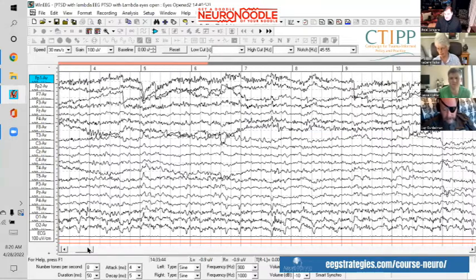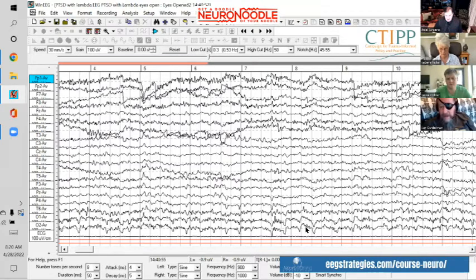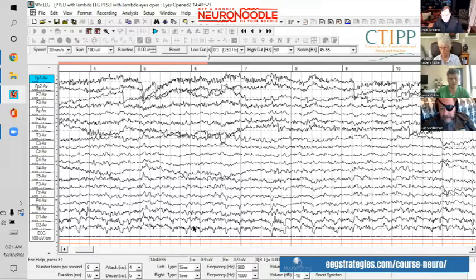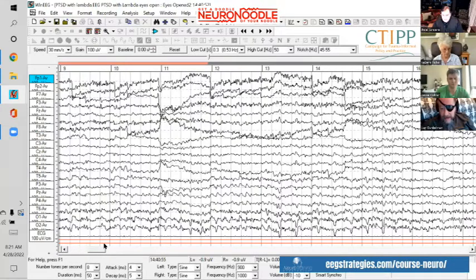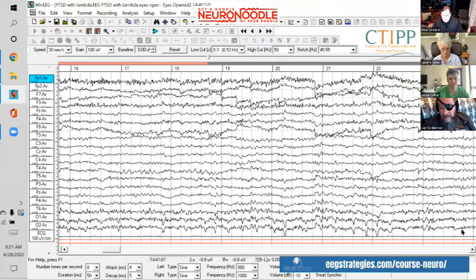You have to know that positive is down in EEG. All of these waves that you see going downward here are basically the person focusing on another thing. Normally, when you ask somebody to have an EEG recorded, you tell them to sit there quietly, keep their eyes still, and focus on a spot. But this person is hypervigilant. If you've been traumatized, instead of staring at a spot on the wall, they're looking for something coming — they're vigilant. These repetitive eyes-open discharges at the back of the head that you see all the way through here are not common, and especially in this repetitive nature. This person has had trauma.